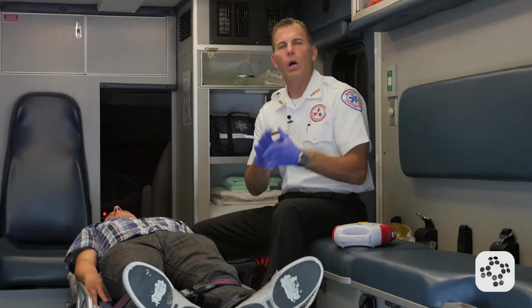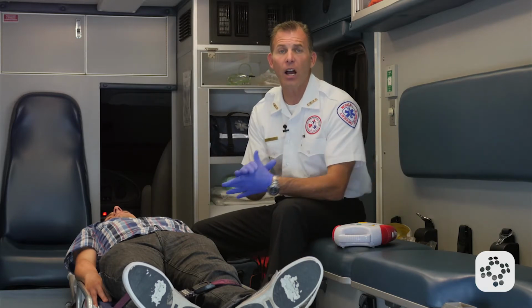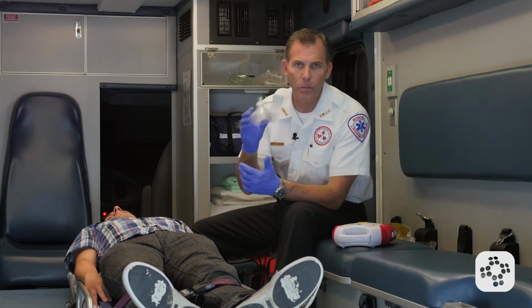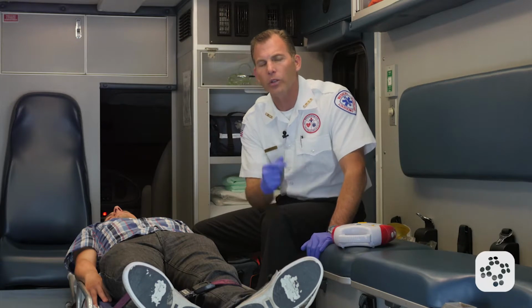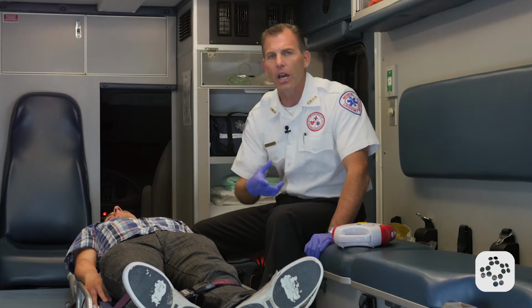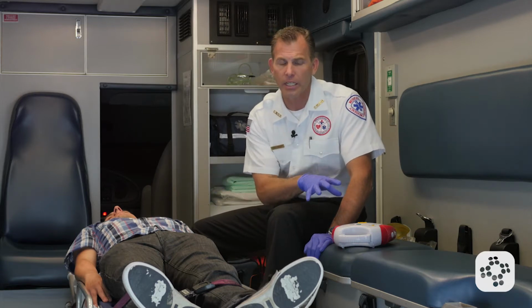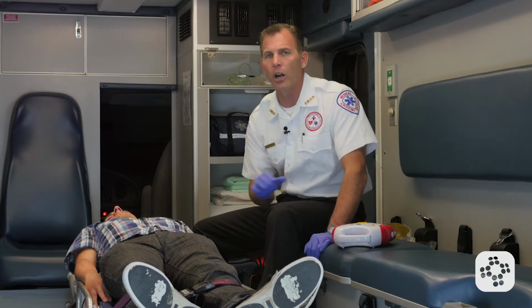Now we're going to cover one rescuer, adult AED for the healthcare professional. Our scene is safe not only for me, the rescuer, with my gloves and my one-way valve rescue mask, but when using an automated external defibrillator, I think it's vitally important that we're also thinking about the surroundings. Are there combustible gases? Are there liquids that are going to connect the patient with me, and I might become electrocuted when I use the AED? These are all considerations that should be thought about as we're preparing to defibrillate our patient.